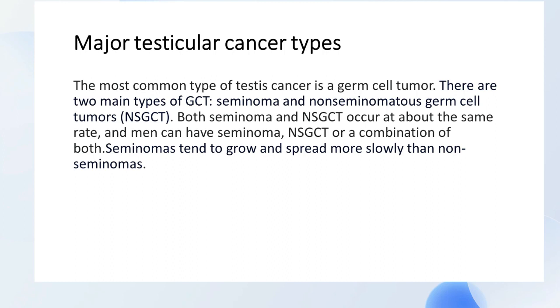So that is all I can say pertaining to these types of cancers. But biopsy will do the rest. Otherwise, if we are going to be overzealous trying to do microscopy using ultrasound, you have problems.